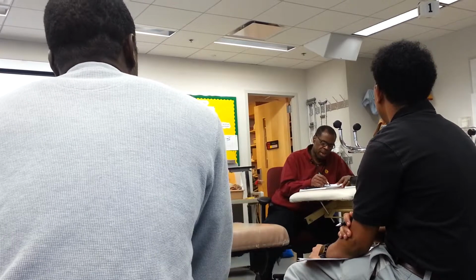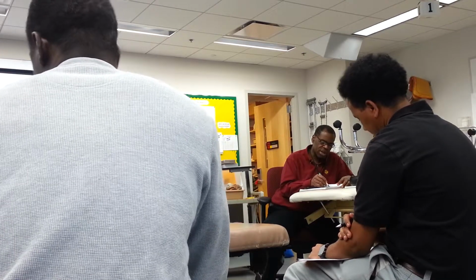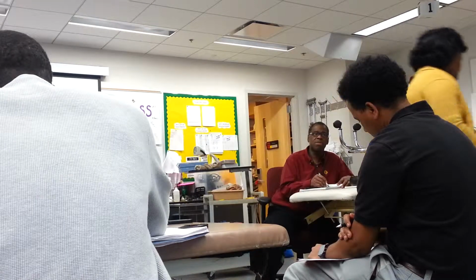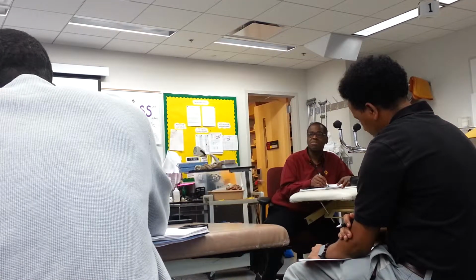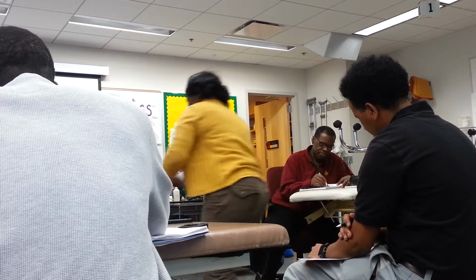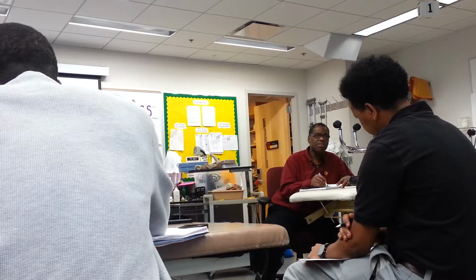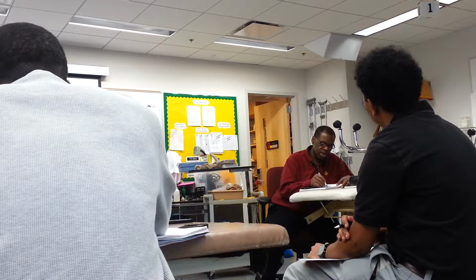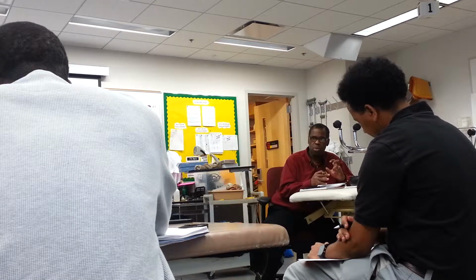So for acute pain, looking at 25 on the left, edema, we'll say that's acute edema, or the person has an 8 out of 10 pain. A muscle spasm, let's say in the upper traps, and it's a lot of pain. Wound healing, peripheral nerve disorders, that's the parameters that we want.